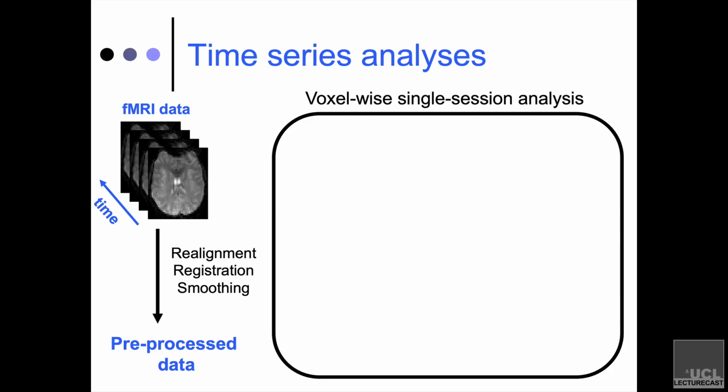That is to say, each voxel is its own thing. It's going to have a univariate analysis. The fact that it's next to another voxel is something that is not going to come up in our statistics at this point. It'll definitely play a role when we talk about statistical inference. And of course, at some level, they aren't really independent of each other for all of the smoothing that we've already done to the data. So some of the interpolation that we've done, as well as the external smoothing kernel that we've applied, means that voxels that are next to one another aren't independent of one another. Nonetheless, we will treat each of them as independent, and this is that mass univariate approach.